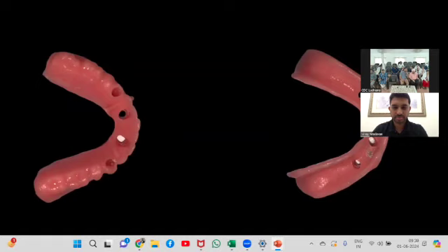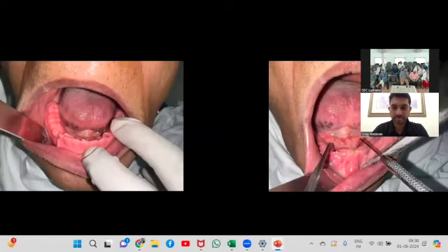This was duplicated by our resident Dr. Subin and his friends. In the CBCT the bone was not great in the canine region, so we thought we'd go with implant positions A, B, D, and E between the mental foramens. We wanted the exit to be favorable also, and not go too labial.